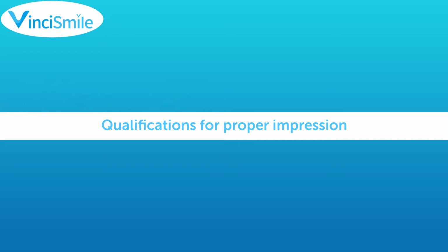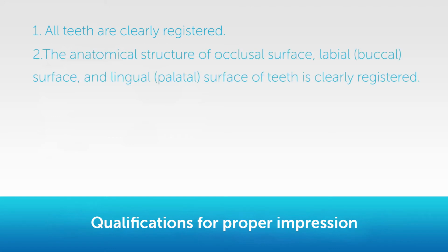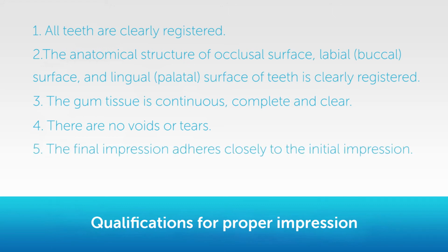Qualifications for proper impression. 1. All teeth are clearly registered. 2. The anatomical structure of occlusal surface, labial-buccal surface, and linguopalatal surface of teeth is clearly registered. 3. The gum tissue is continuous, complete and clear. 4. There are no voids or tears. 5. The final impression adheres closely to the initial impression. 6. No demolding.